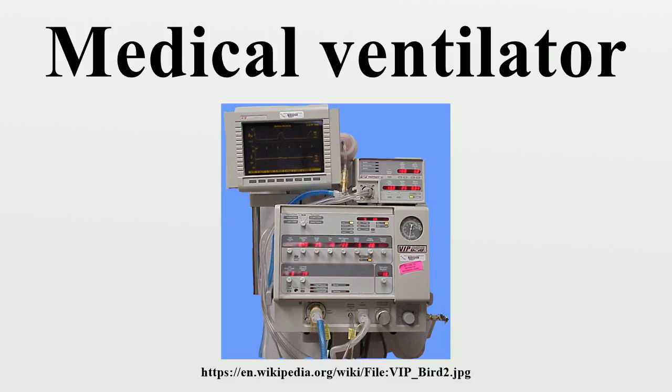When overpressure is released, the patient will exhale passively due to the lungs' elasticity. The exhaled air is released usually through a one-way valve within the patient circuit, called the patient manifold. The oxygen content of the inspired gas can be set from 21% to 100%. Pressure and flow characteristics can be set mechanically or electronically.